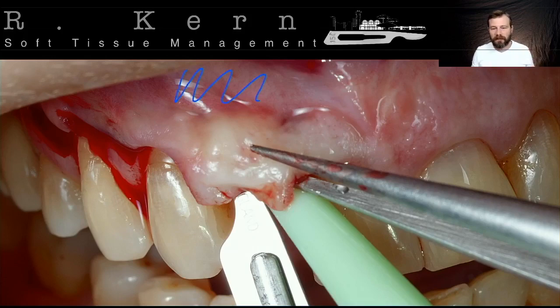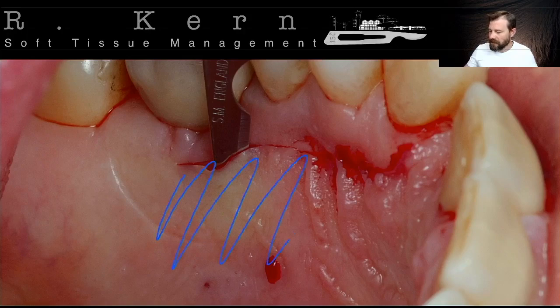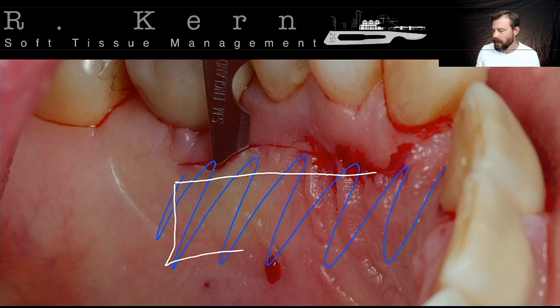There is a lot of benefit in that. I cannot cover all this benefit today, but it is the basic preparation for the flap that is going to nourish and protect the pedicle. And here's the pedicle. We open a window large enough to access a pedicle at least with the same width of the defect.